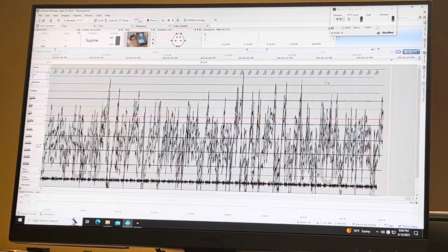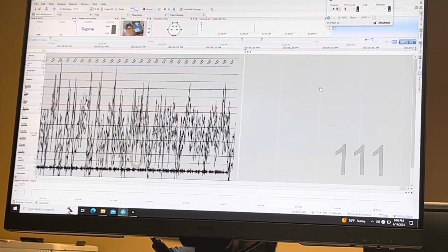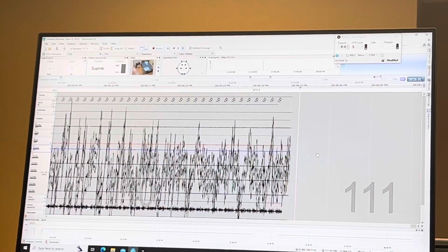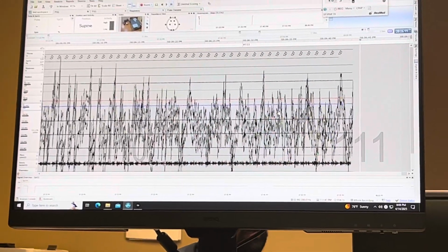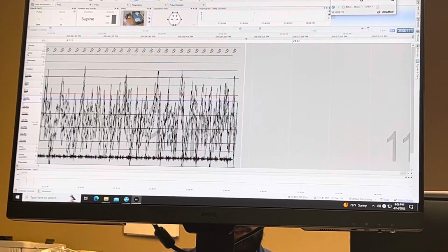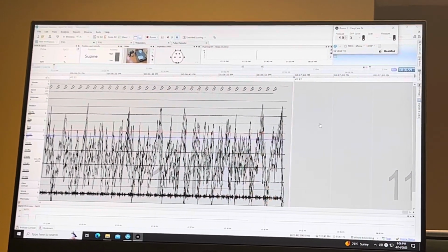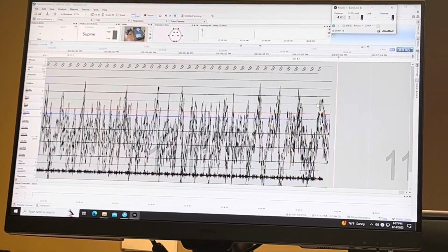Would it hurt, because most of our patients are splits, right? Before we start the study, could we have the CPAP already added so you don't have to stop it? We would still recommend doing it this way. The reason is once you connect to the ResMed, even if it's not on, it's going to think your patient is on 4 centimeters. So if you were to generate a report on that split patient, it's going to think they were on 4, and that's going to read out on the diagnostic report.